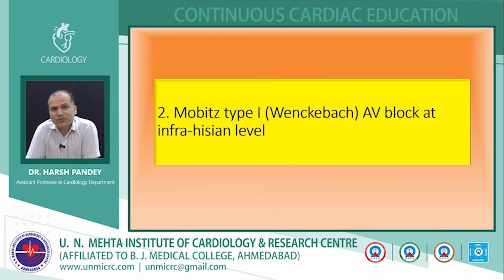Second thing, Mobitz type 1 Wenckebach phenomenon at the infra-His level. So this is also an atypical finding.